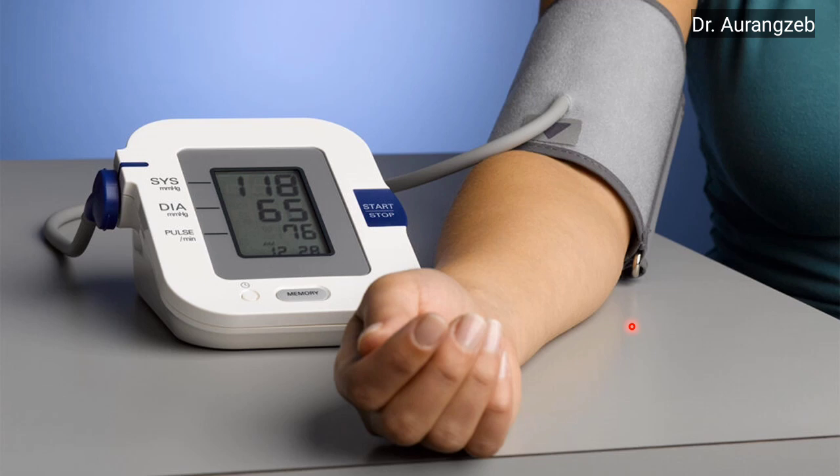Here we can see that for an automated device, the manufacturer specifications should be followed. Generally, the bladder should be at the level of the heart, and you have to push this start button. Once it calculates your blood pressure, you will get this systolic reading, this diastolic reading, this pulse. You then stop. You can then store this as well for future record and reference.